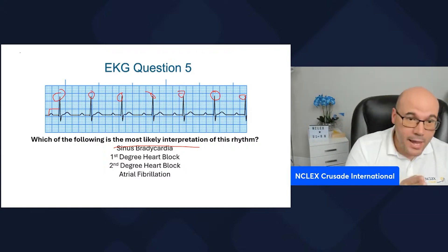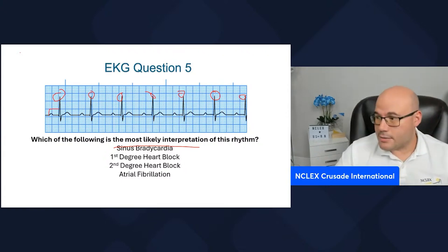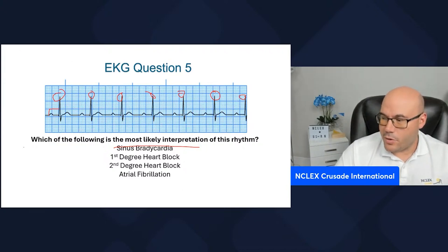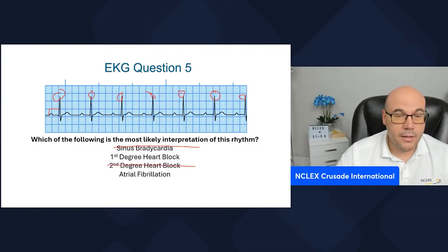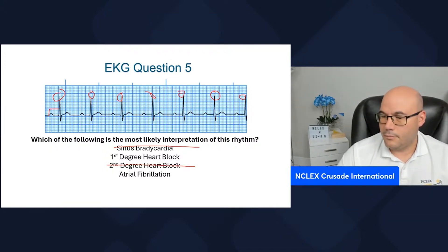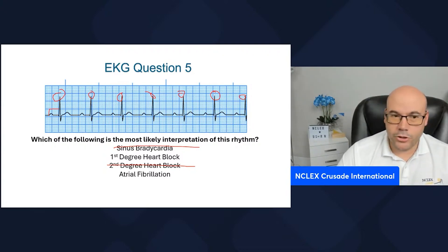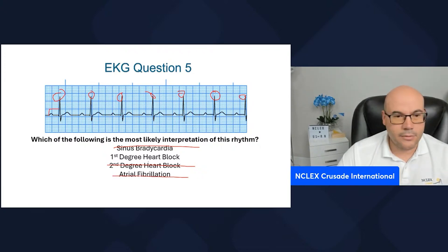We have a P and a QRS all the time, which means we don't have a second degree heart block, because a second degree heart block is missing QRS complexes. And I don't see multiple P waves, and if I don't see multiple P waves, it cannot be atrial fibrillation.